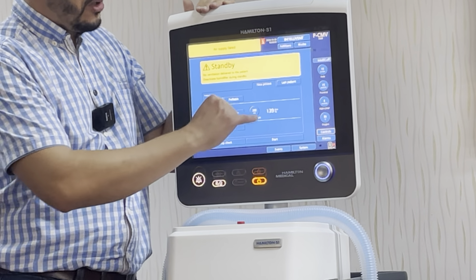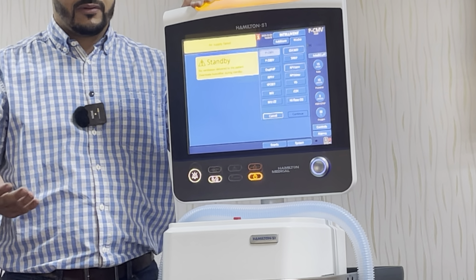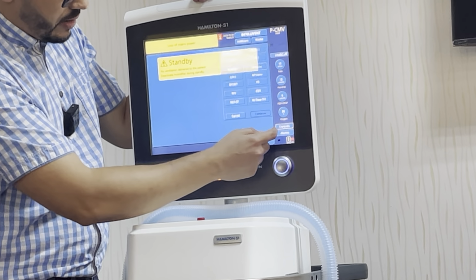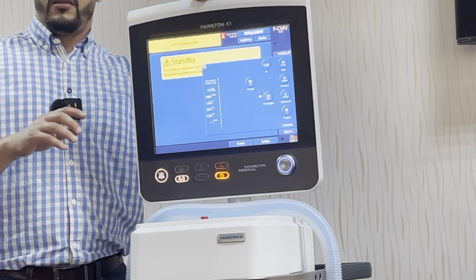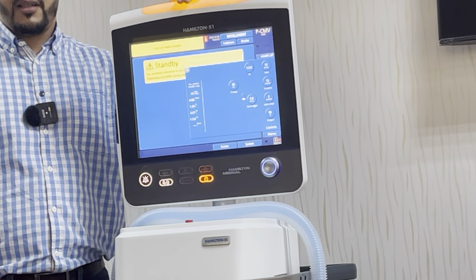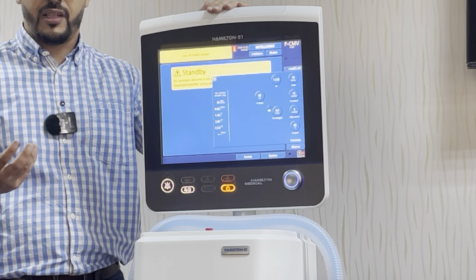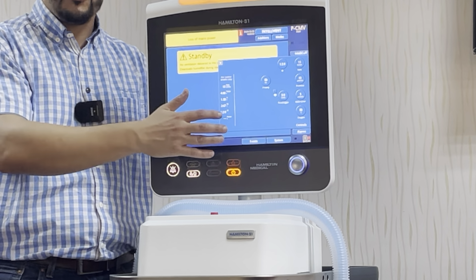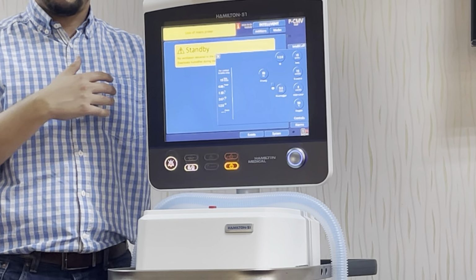So that's why the CMV mode and PCMV mode were upgraded. How was this upgrade done? By adding one new parameter, which is the trigger. Normally the mandatory modes don't have any trigger because the machine is already mandatory, so there is no need for a trigger. But if we add the trigger parameter, the patient is able to tell the machine, I'm here, I'm starting to breathe. So the machine will be able to sense and detect any spontaneous breathing coming from the patient.